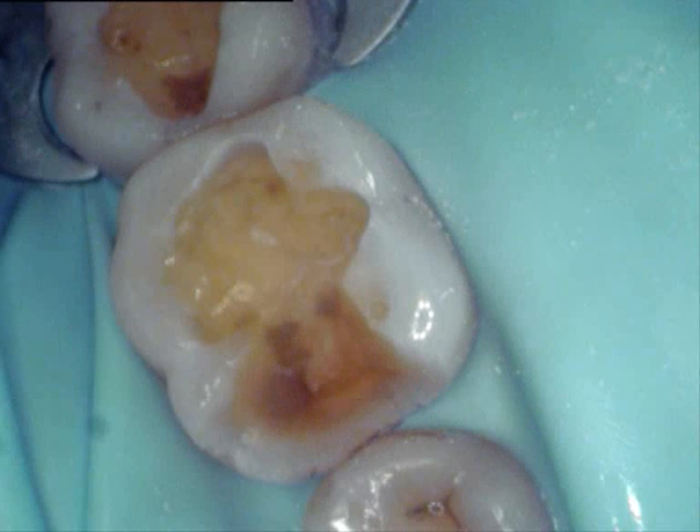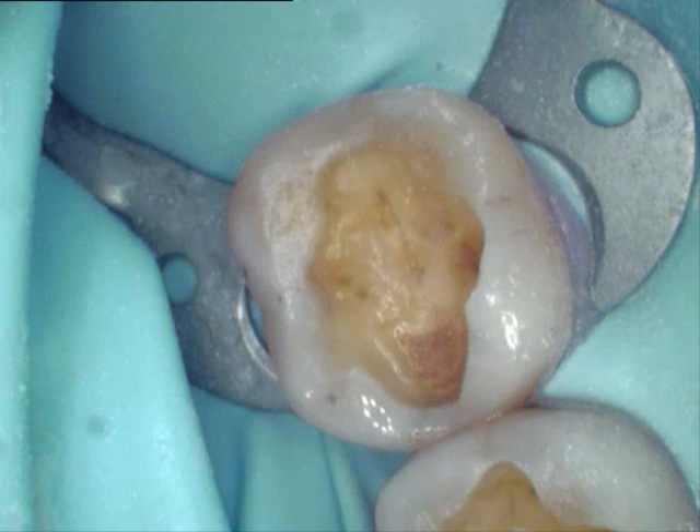An air abrasion unit has now been run over the teeth, which is essentially a mini sandblaster. It removes all the rough pieces of enamel and prepares the tooth with a nice frosty appearance. This increases our bond strength and gives us a better filling.